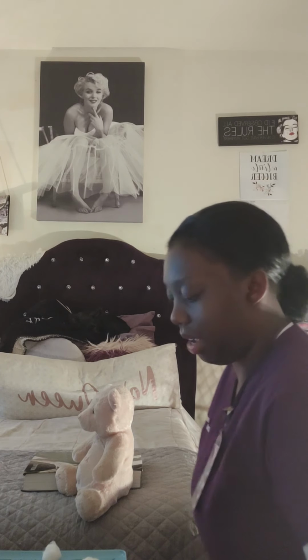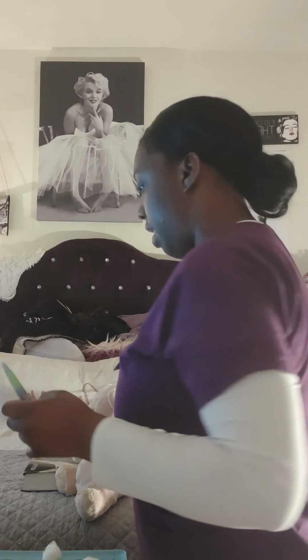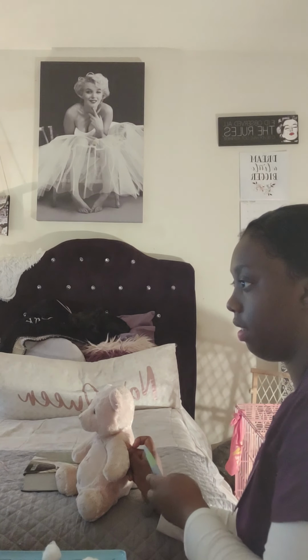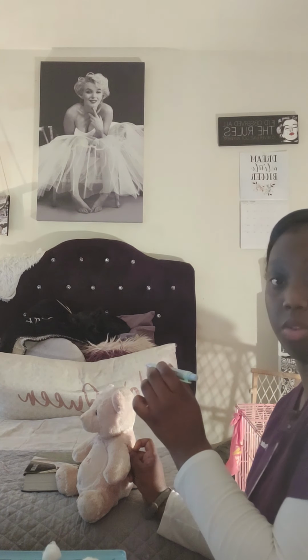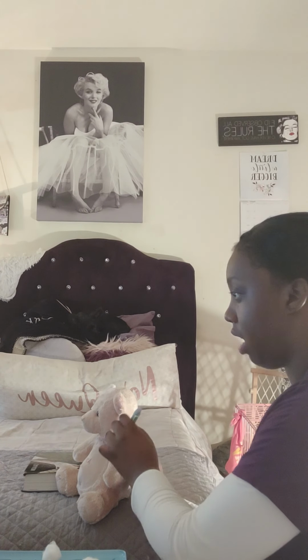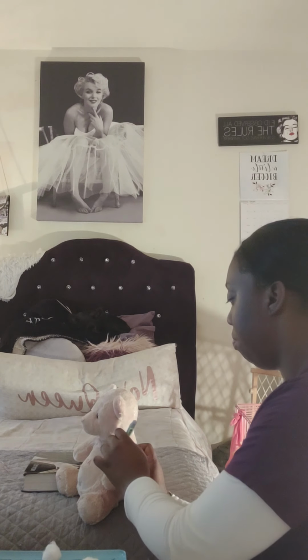Allow the area to dry. Take your needle, uncap it, and then using the Z-Track method, use your non-dominant hand to spread the skin, hold the needle, and inject it about an inch to an inch and a half in. Alright, so with the darting motion, you just boop.